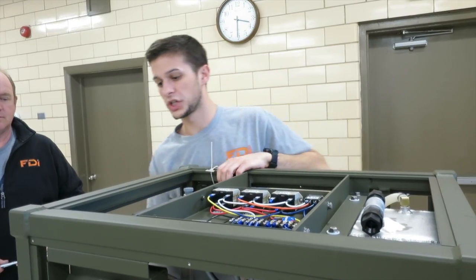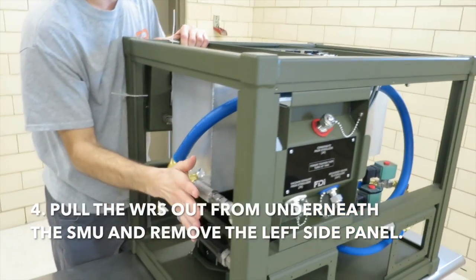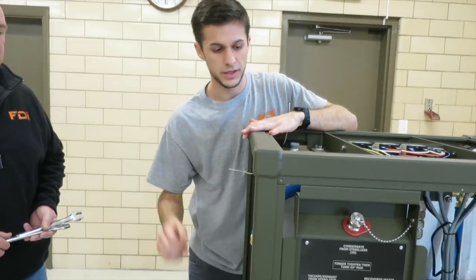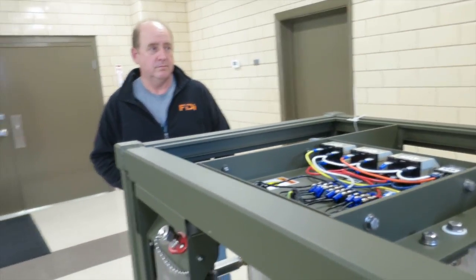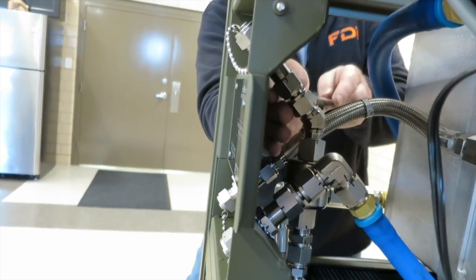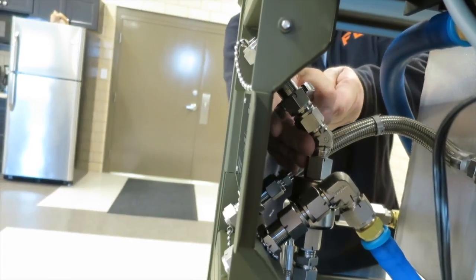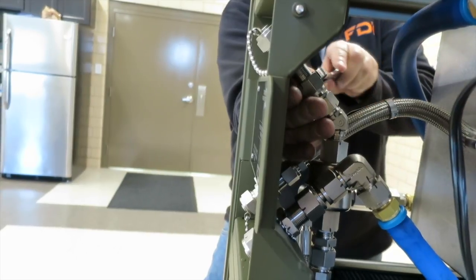And then you are just going to have to remove the left side panel, which from this bulkhead will be this panel right here. Now we have all the panels removed so we can video this, so I'm going to let Steve get to work. So first, step number 5 in the manual, we're going to disconnect the top of the steam trap using a 7/8 inch wrench. And you don't have to counter torque. There's actually a retainer on that bulkhead that will hold it as he loosens it.